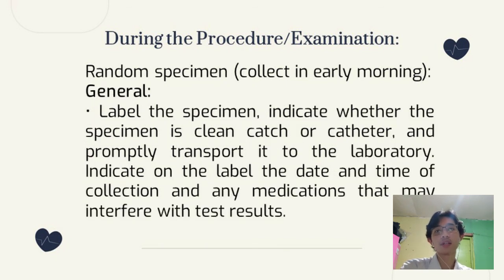Next, for general, label the specimen, indicate whether the specimen is clean catch or catheter, and promptly transport it to the laboratory. Indicate on the label the date and time of collection and any medications that may interfere with the test results.